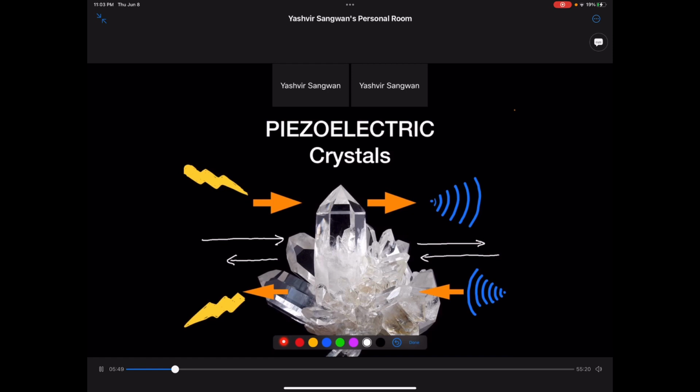When people, for example, the folks from Butterfly, tell you that their technology is somehow better or different because they do not use piezoelectric crystals, but they use chip technology, the point is that the chip does not vibrate. The chips are connected to electrodes. The electrodes have metal plates suspended in between.